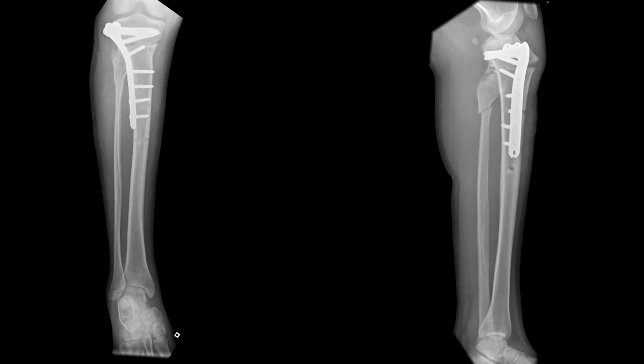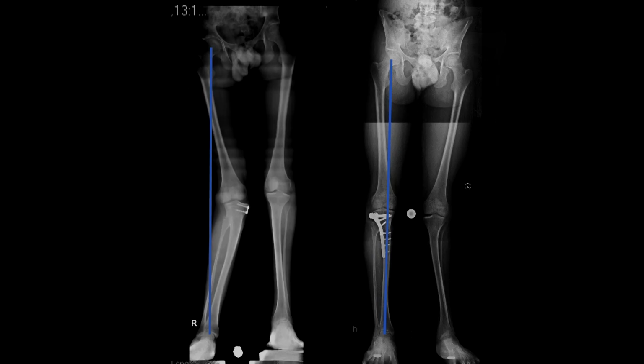It's never a dome. So this barrel osteotomy, correction, and then compression, that makes the stability, the shared stability between the osteotomy and the implant such that you can use a standard trauma implant. That is, the compression makes a big difference to the shared stability between the implant and the osteotomy site. So here you have basically a lateral proximal tibial plate that's used. That's the correction, and that's the healed and final result. Just to give you some evidence that the axis has actually improved.